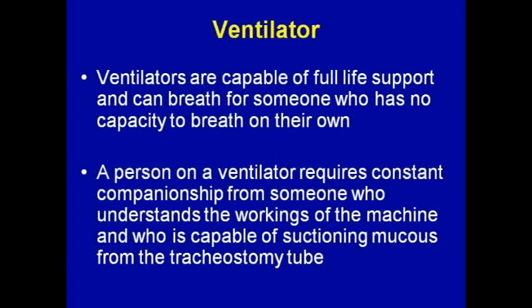Ventilators are capable of full support. Somebody who has essentially zero diaphragm function can live with the full ventilatory support of a ventilator. It can really take over the capacity for somebody who is unable to breathe on their own at all. A person who is on a ventilator requires that somebody be with them really 24 hours a day. And it can't be the same person, obviously, because nobody can be awake and caretaking for another person 24 hours a day.